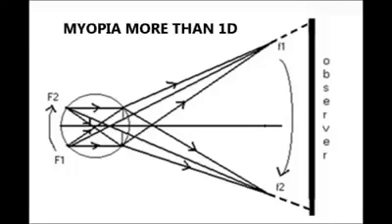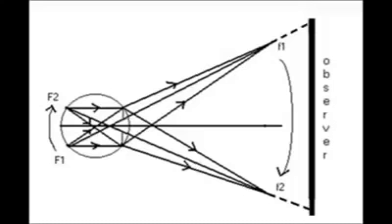The light rays emerging out of the patient's eye are convergent and meet at a point between the patient and the observer, and hence the movement is opposite to that of the plane mirror, that is, against movement. This procedure, retinoscopy, gives us the gross value of the refractive error of the patient's eye. To get the net value, we deduct the working lens from the gross value.